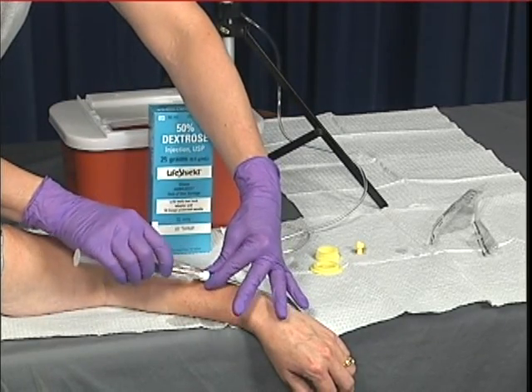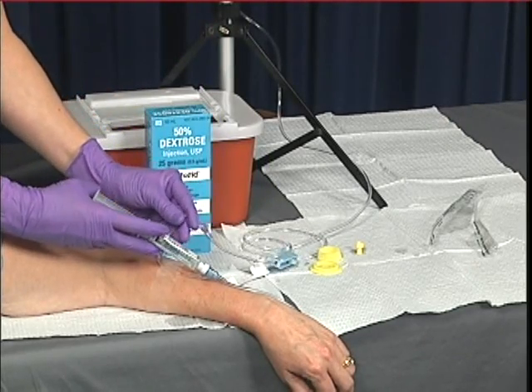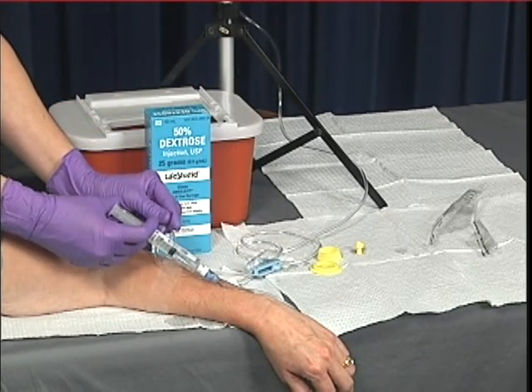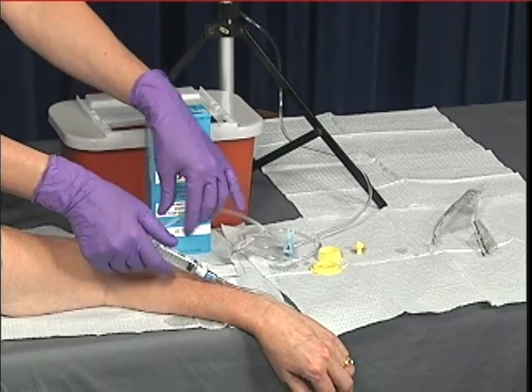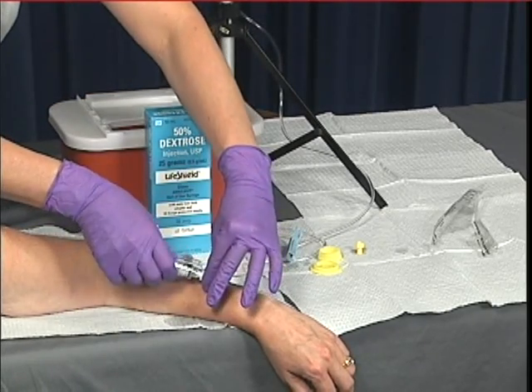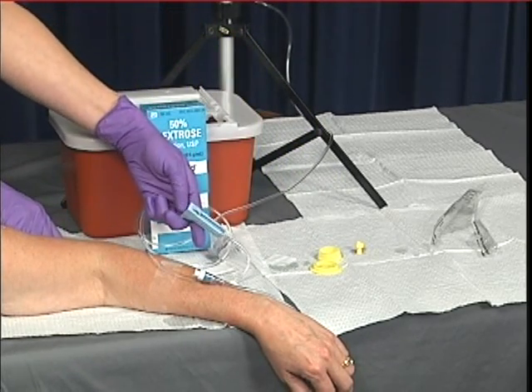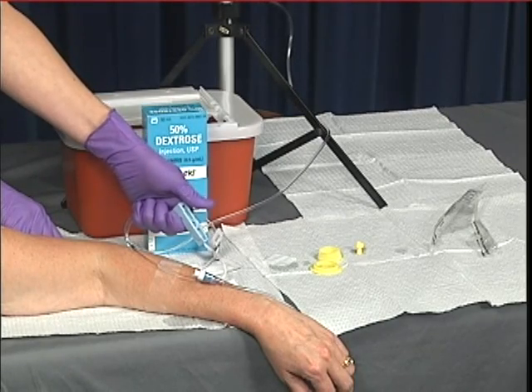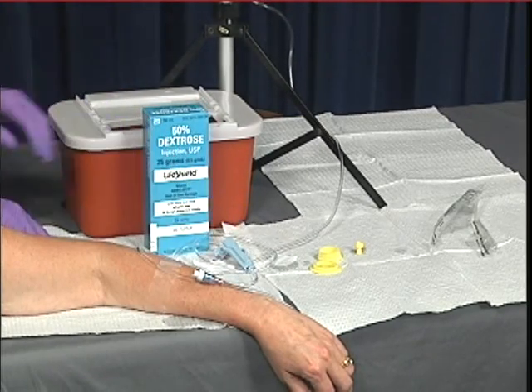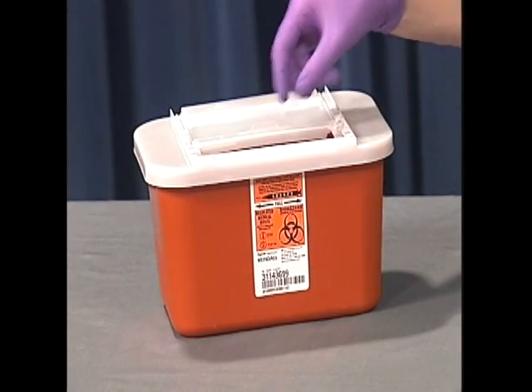Make sure to reset the flow rate appropriate per patient presentation. Properly dispose of the syringe and needle assembly.